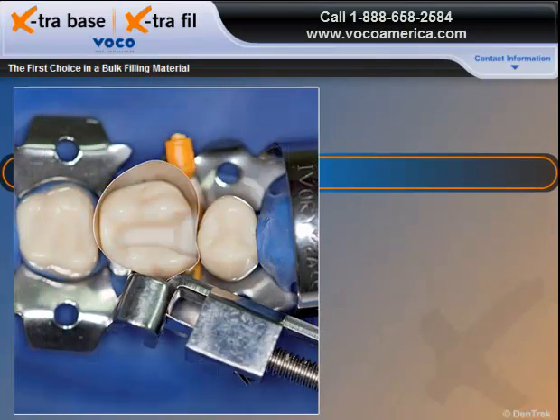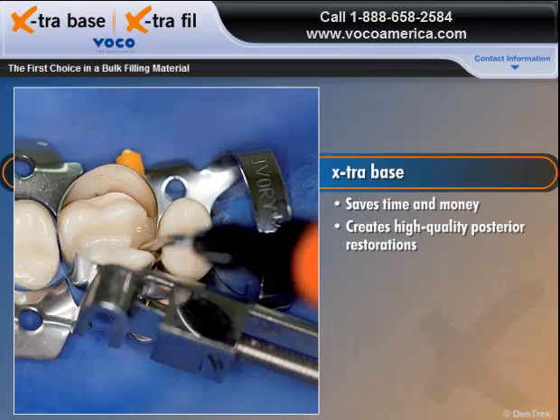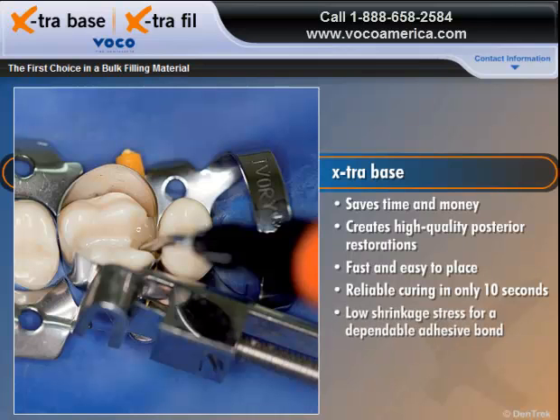When used as a base for Class 1 and Class 2 cavities, Extra Base enables you to save time and money while creating high-quality posterior restorations. Fast and easy to place, Extra Base delivers reliable curing in only 10 seconds while providing low shrinkage stress for a dependable adhesive bond.